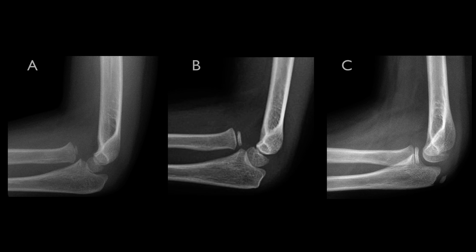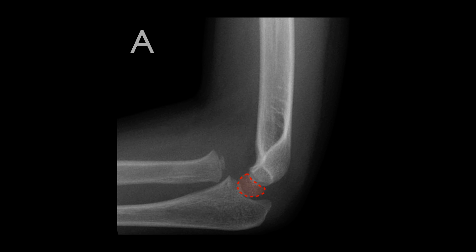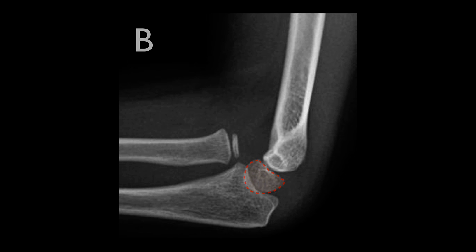Let's look at our cases again. Here's case A. Let's highlight the capitellum and the radial head and neck. When we draw the radiocapitellar line it doesn't intersect the capitellum — this radial head is dislocated. Moving on to case B, we can highlight the capitellum again. With the radial head and neck outlined we can draw the radiocapitellar line. Again we see that it doesn't intersect with the capitellum — the radial head is dislocated.